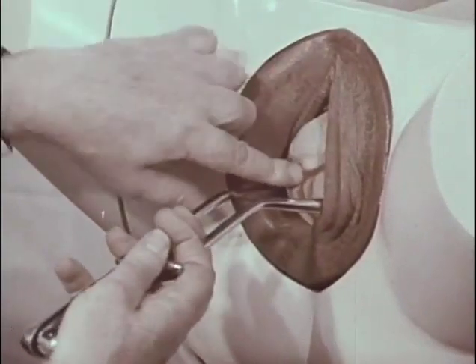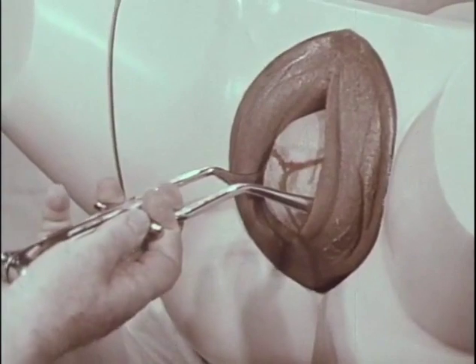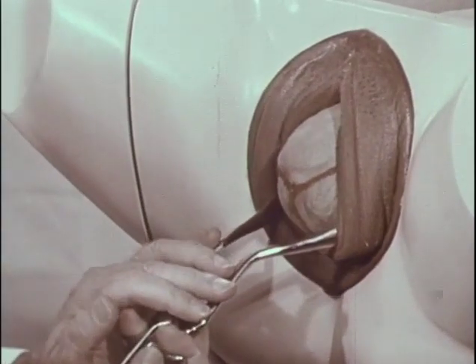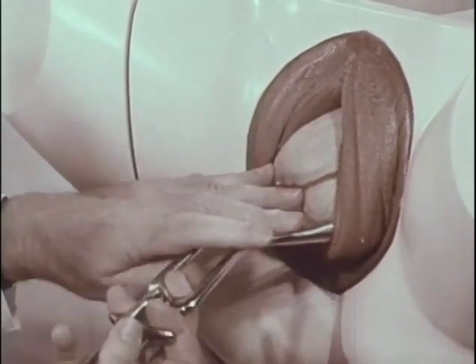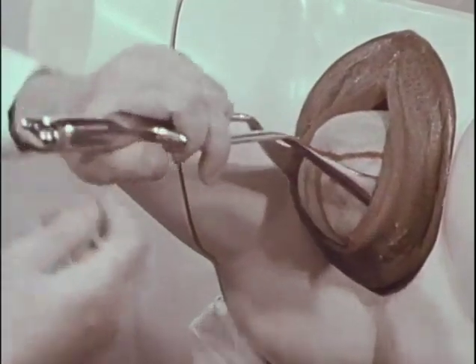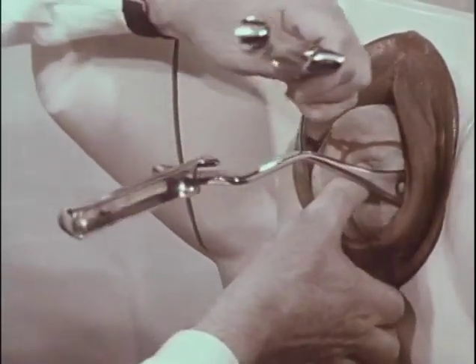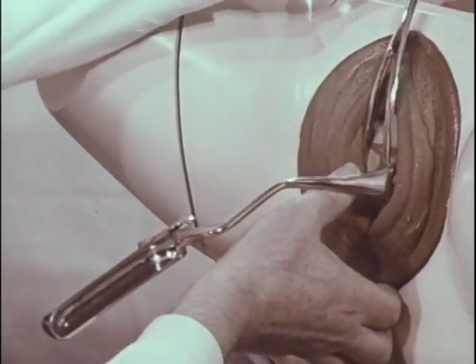Sit down, proceed with traction. Depress the handle so that the suboccipital region can be encouraged to come under the symphysis, and then the head is ready for extension over the perineum. As soon as it's controlled by the Ritgen maneuver, the blades are removed.